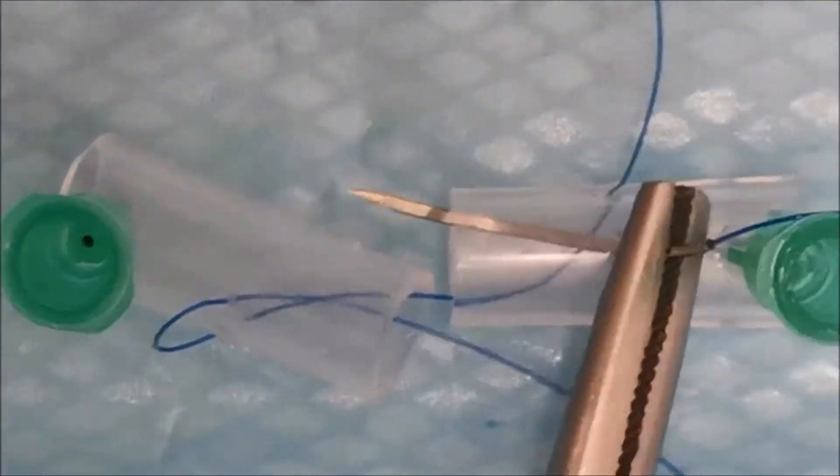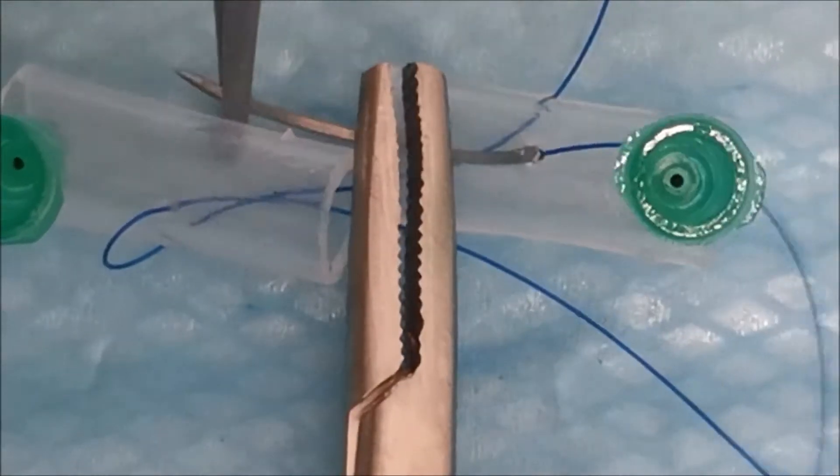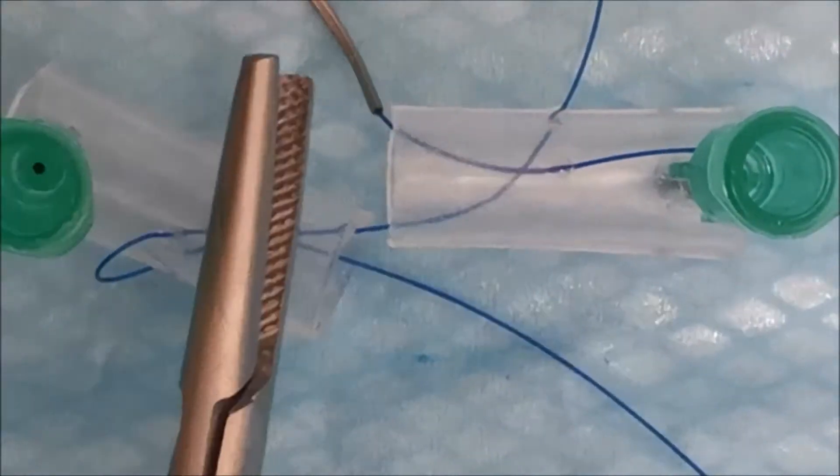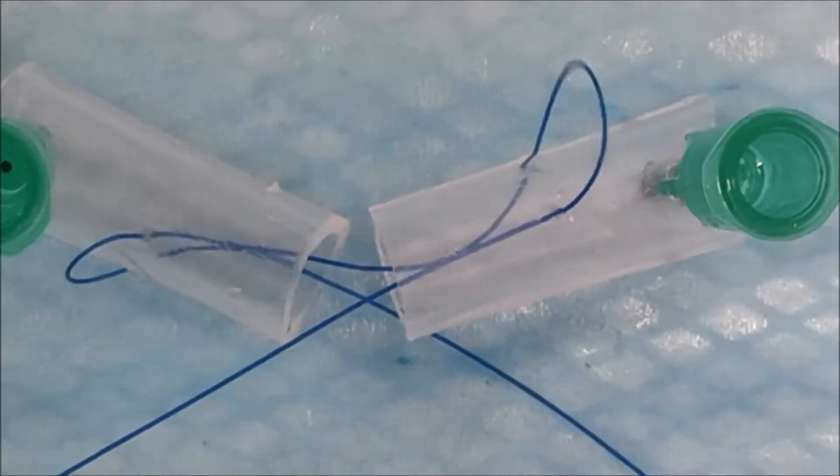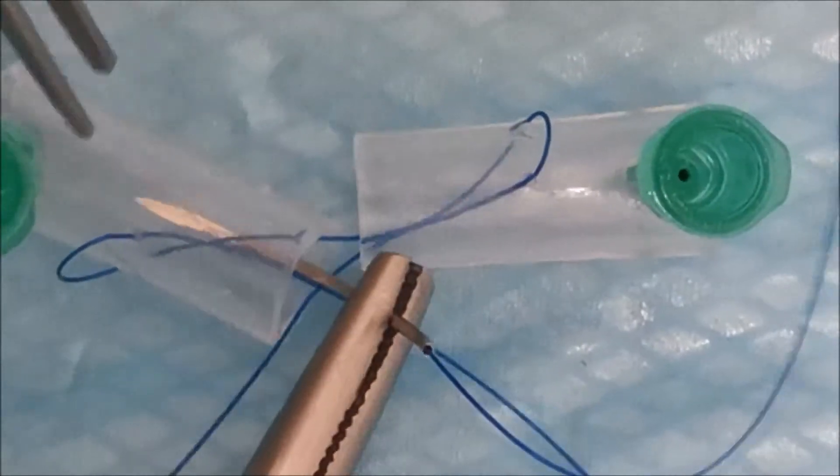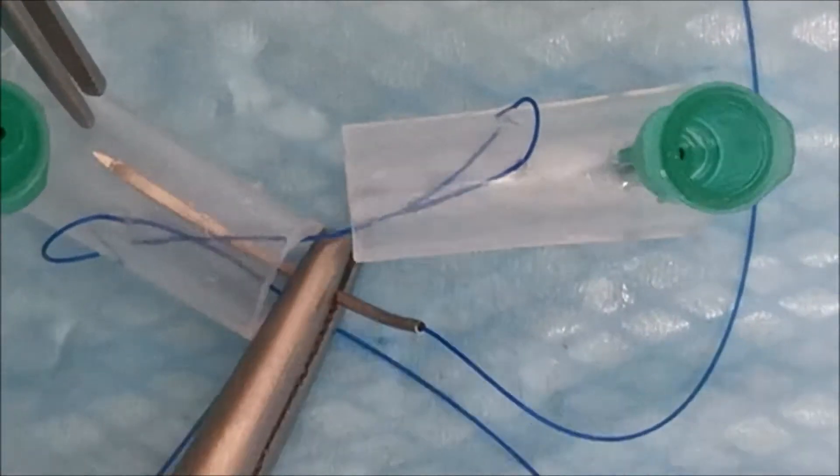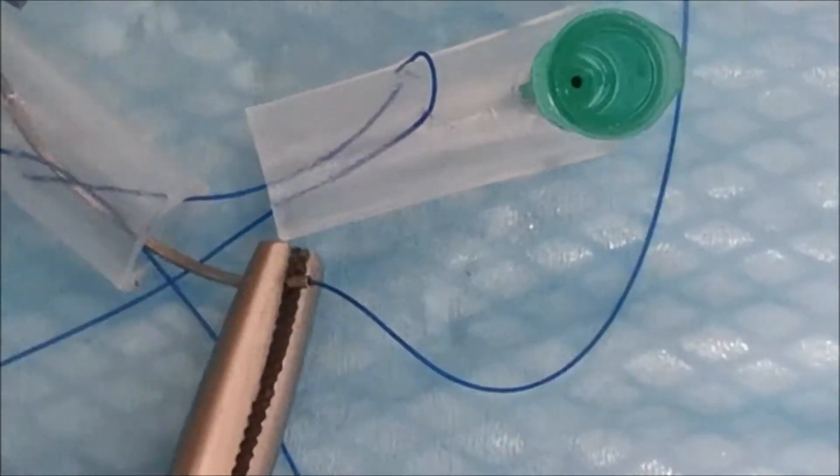In order to remember this, if you go in on the side on one tendon end, you come out on the side on the other tendon end. If you go in centrally on one tendon end, you come out centrally on the other tendon end.